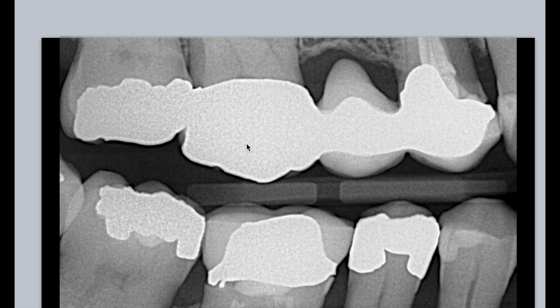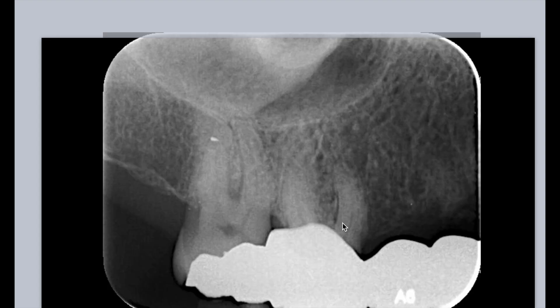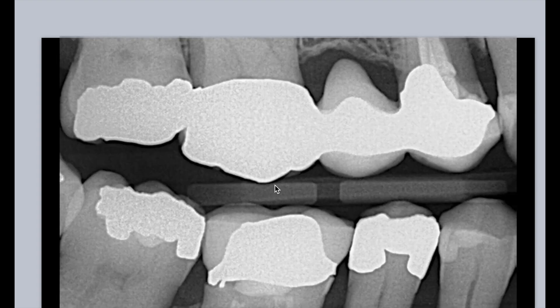If you know this and you've been in dentistry for two years, you're way ahead of the game. I didn't learn this until about a decade ago. Even if you have a restorative before the crown, if the patient's in your practice, take a look at the bite wing to see where the pulp chamber is. The periapical comes in at an angle — this crown is superimposed over the pulp chamber — but the bite wing gives us a perpendicular image.